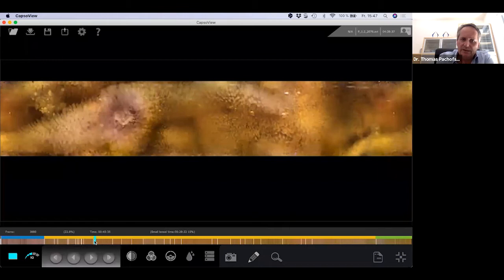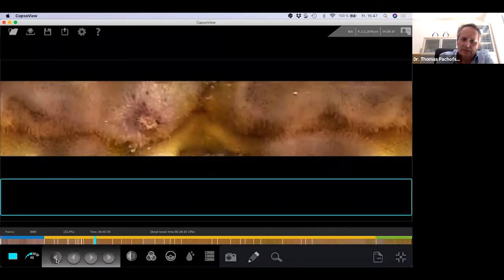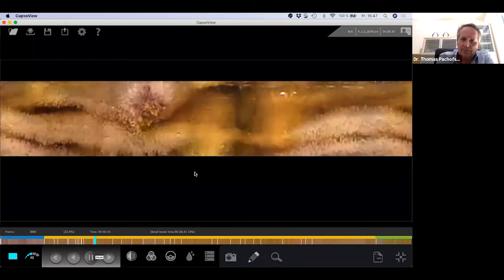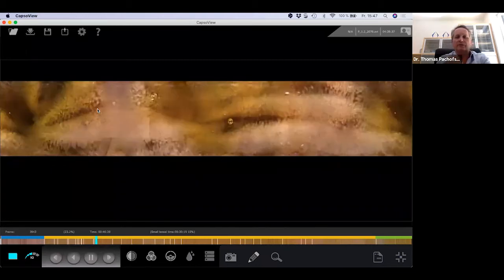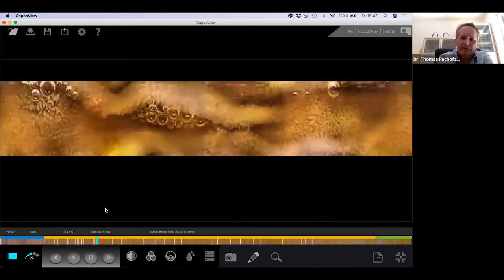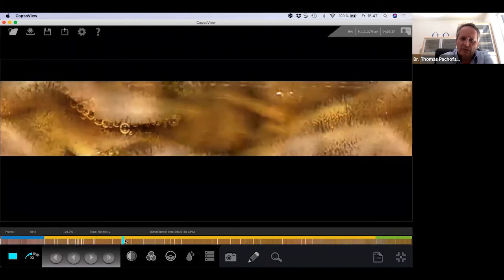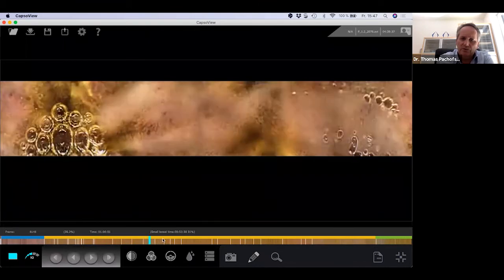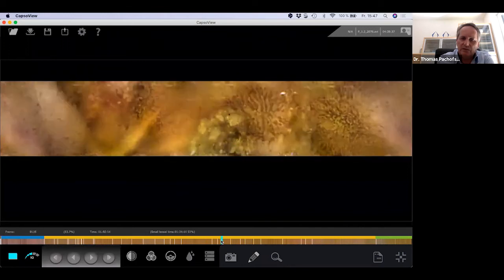And we have areas where there's nothing. We have areas here with the next ulcer. The rest of the mucosa is quite well. We don't have a severe inflammation in this area, but I will show you another area, because here we are in the jejunum. Everything is okay, if you look at those ulcers.